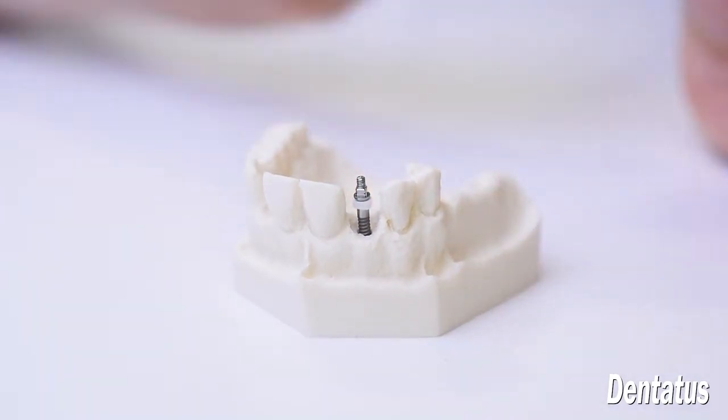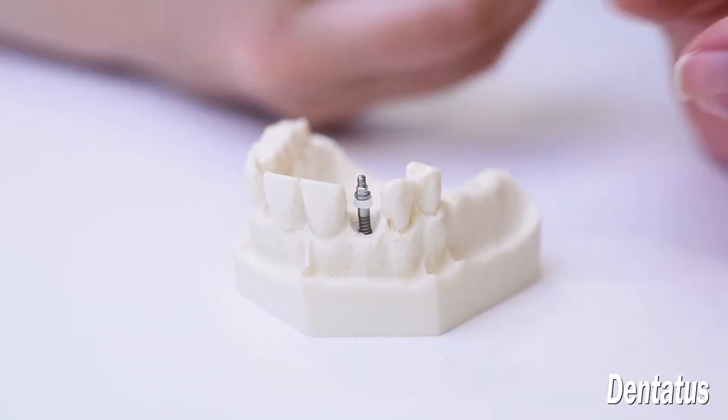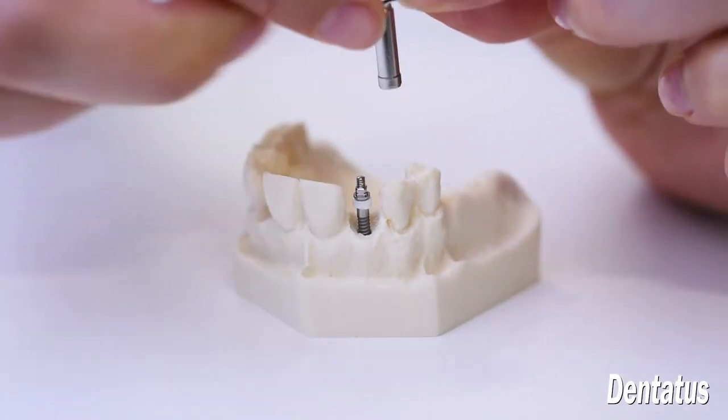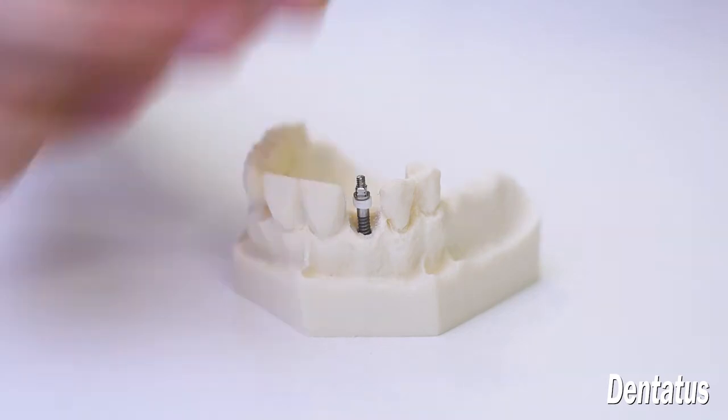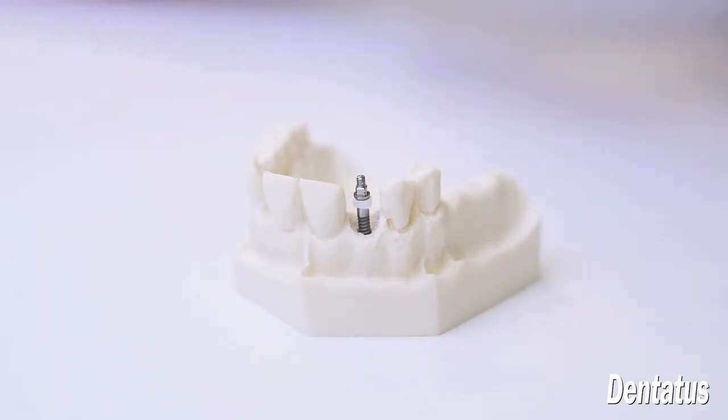There are several options available to seat the implant: the manual driver, the handpiece driver, or the ratchet.